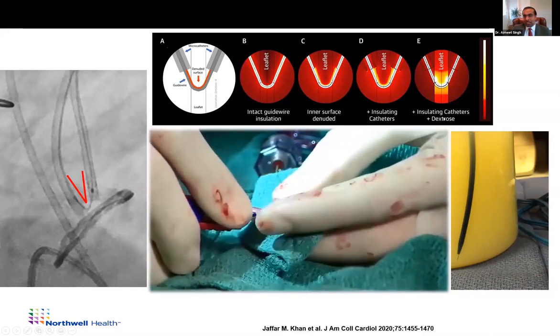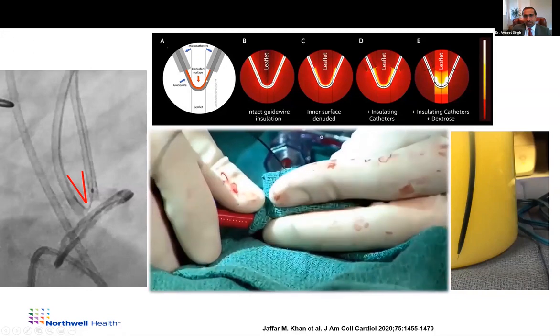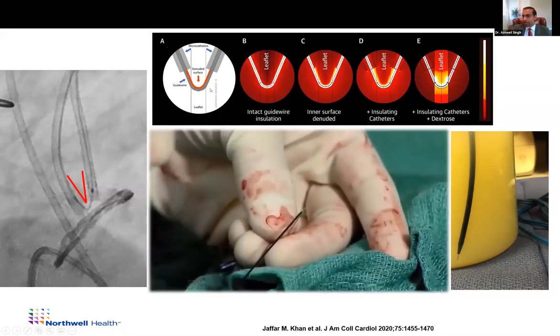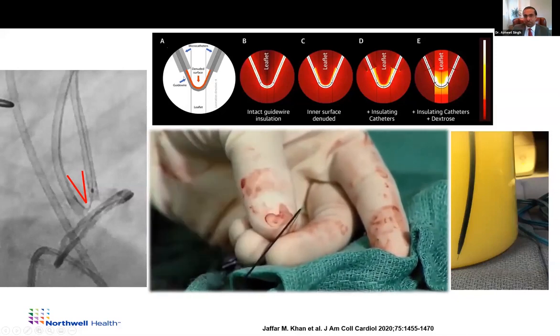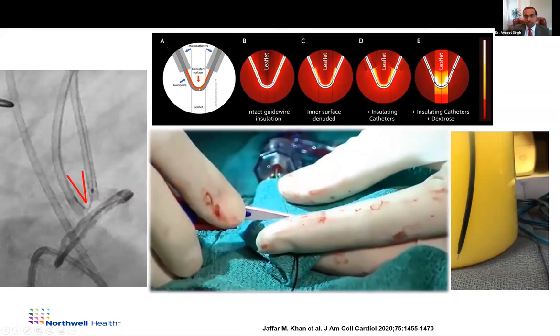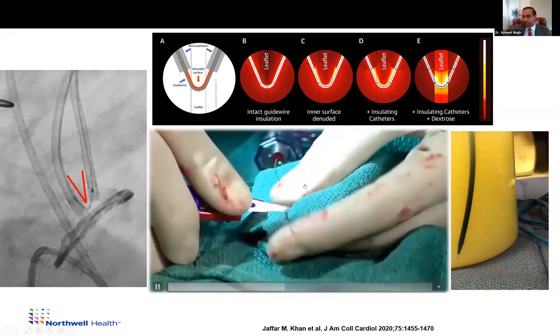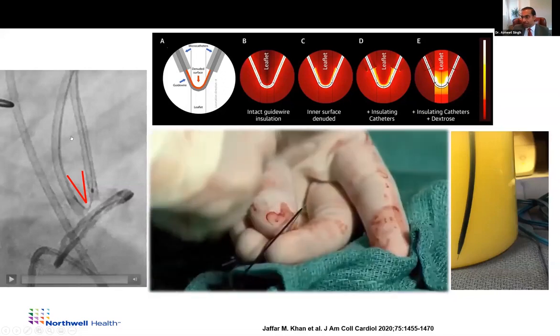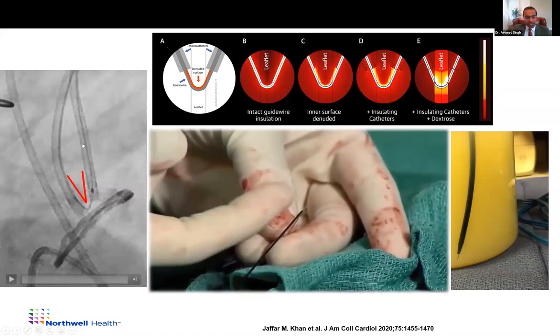And then you want to inject dextrose that will prevent loss of current on the other side where now the wire may be coming in contact with the blood. So you're getting rid of as much blood and as much saline as you can. So you're focusing your current on the inner part of the flying V. This is important to understand, otherwise you can be tugging on this really hard, and that can cause inadvertent injury to other structures.